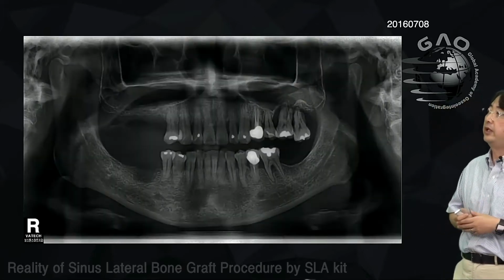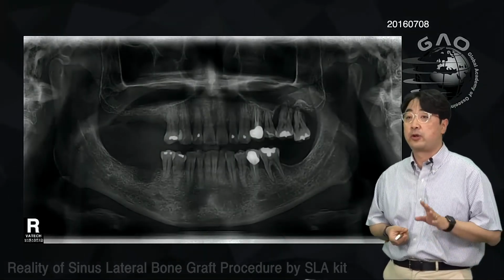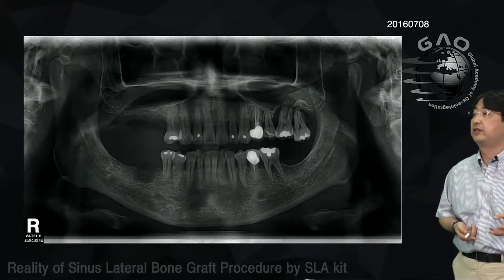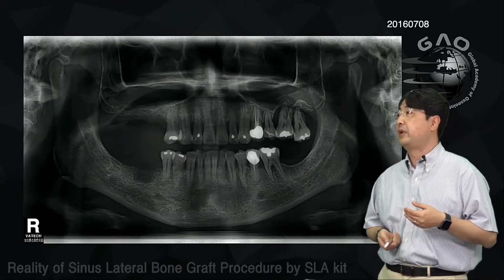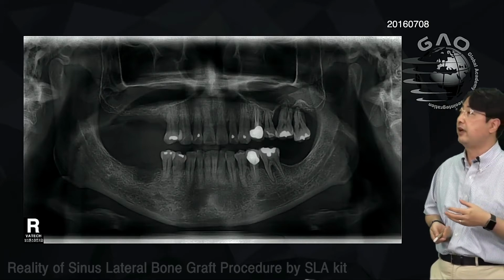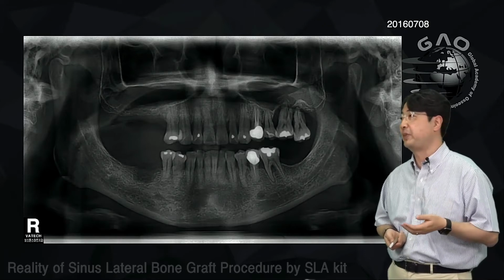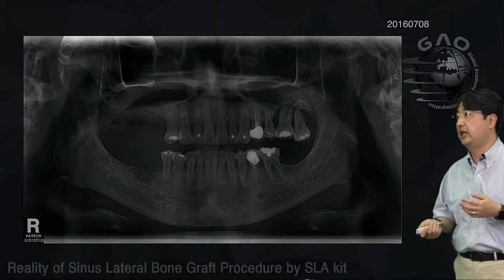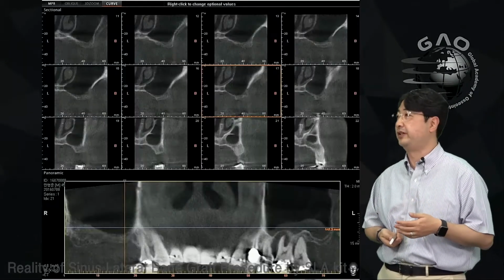Like this. Okay, so here we have another case, and actually this patient was referred from one of my colleagues. This patient already had a sinus graft on the upper right side. Then my colleague found a perforation during the sinus graft, so he stopped and waited for a few months. Then he referred this patient for the sinus graft on the right side, right? Well, as you see here, this patient has to go for the implant on the upper left as well.